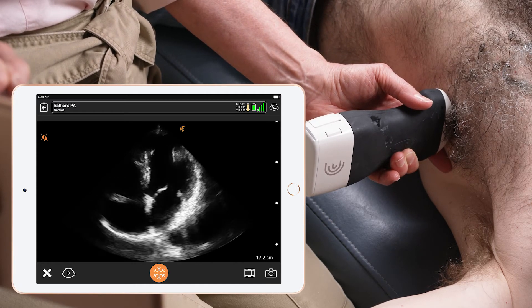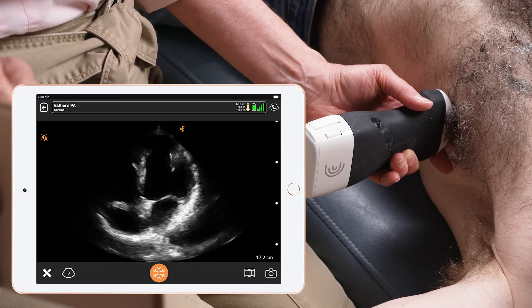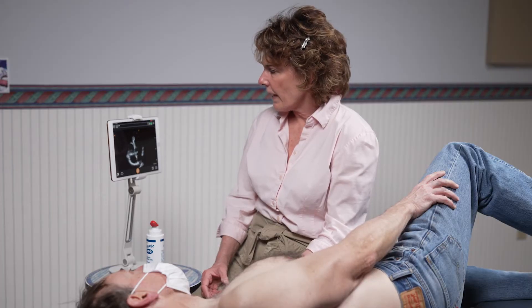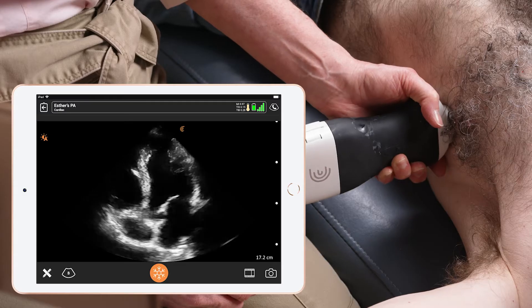I'm just moving my scanner down another rib space to try to obtain the best image possible. Once I'm satisfied with that, I'm going to use color Doppler flow to look for any regurgent jets.